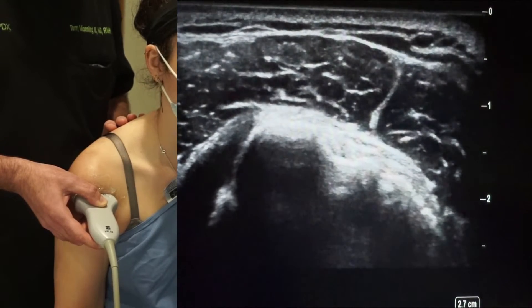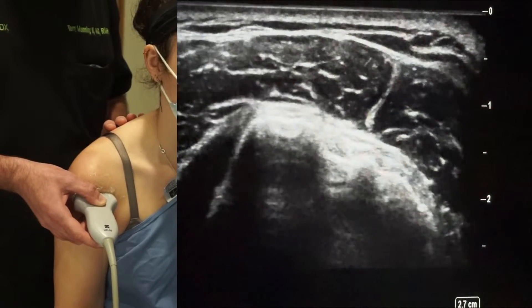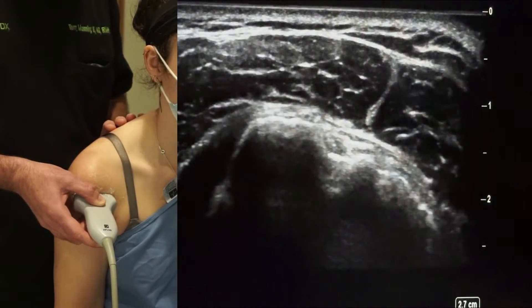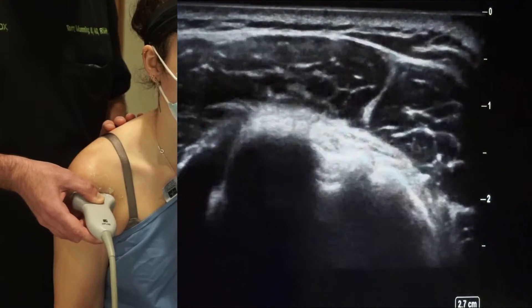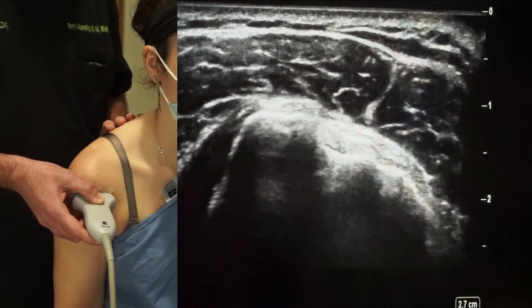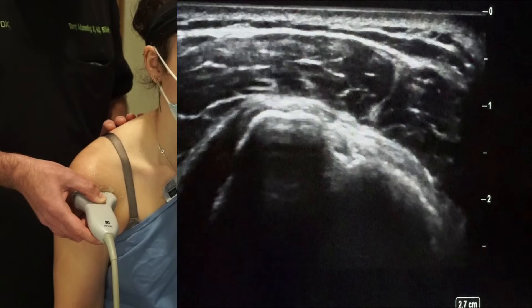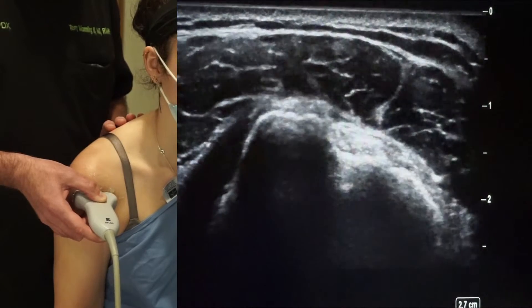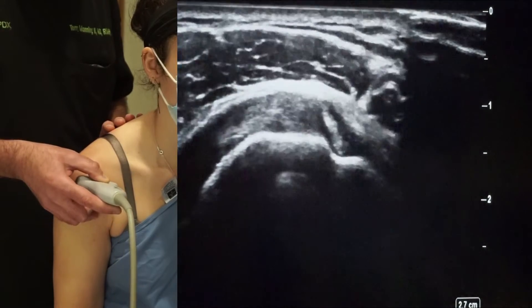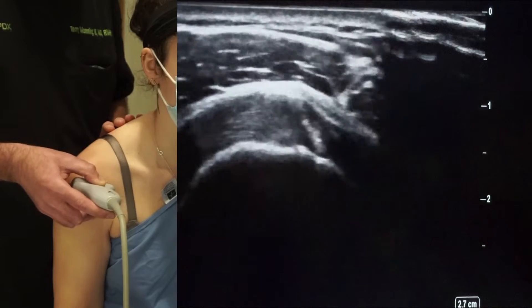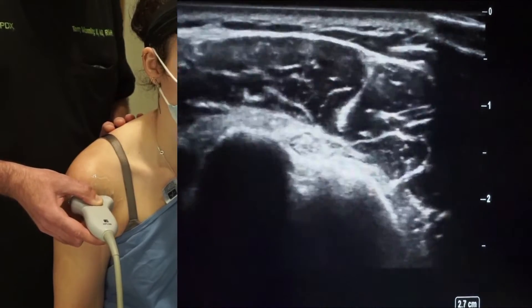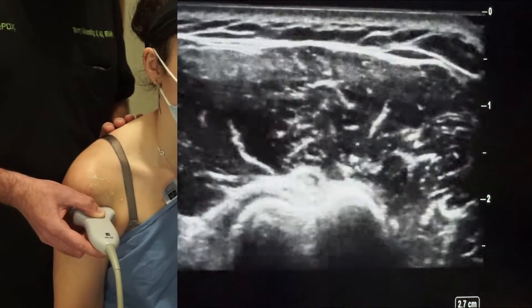We'll start by looking at the anterior shoulder. The first structure we're going to evaluate is the long head of the biceps tendon. We're short axis on the biceps tendon. The bright hyperechoic line is the humerus — the head of the humerus. The biceps tendon is sitting in the groove, and we'll follow it up into the groove and then, as we go more proximal, it's going to wrap and go into the rotator cuff interval. Remember that we're not just producing one static image — we're scanning the tissue to find the area of defects.